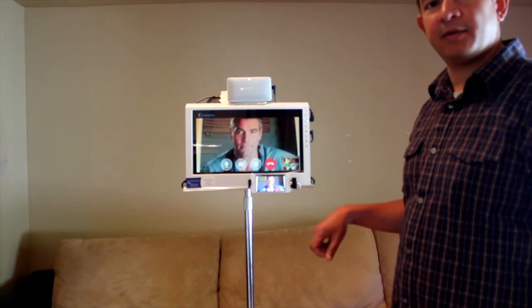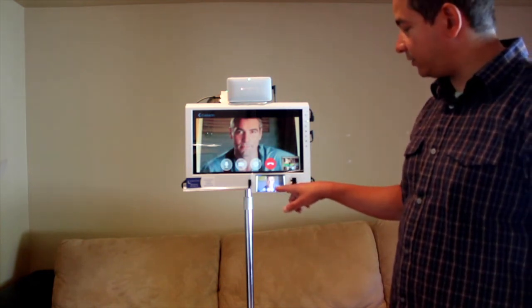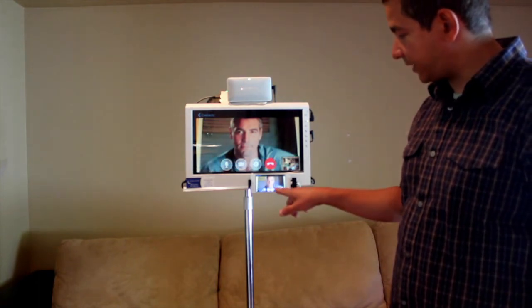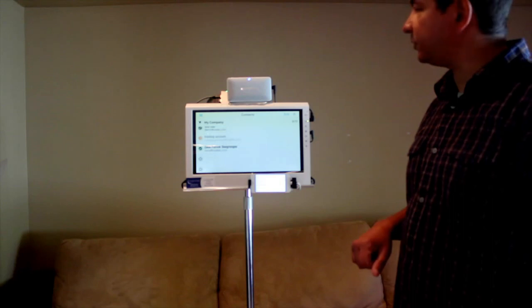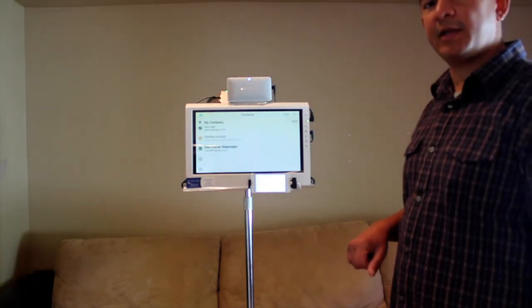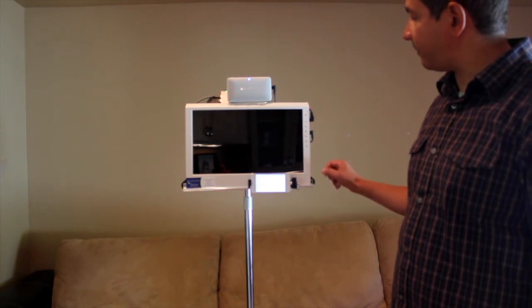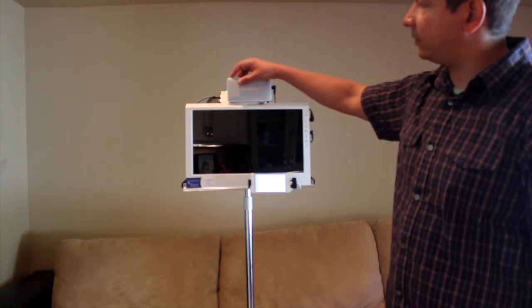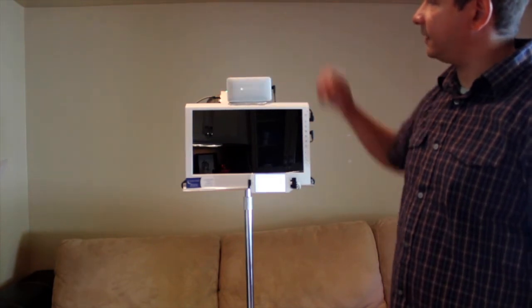Finally, you have the hang up button. Once you're done with your video session, press the hang up button and that will take you back to the address book. To shut off the system, turn the screen off by pressing the second button from the top, and turn the speaker off by pressing that top left button again.